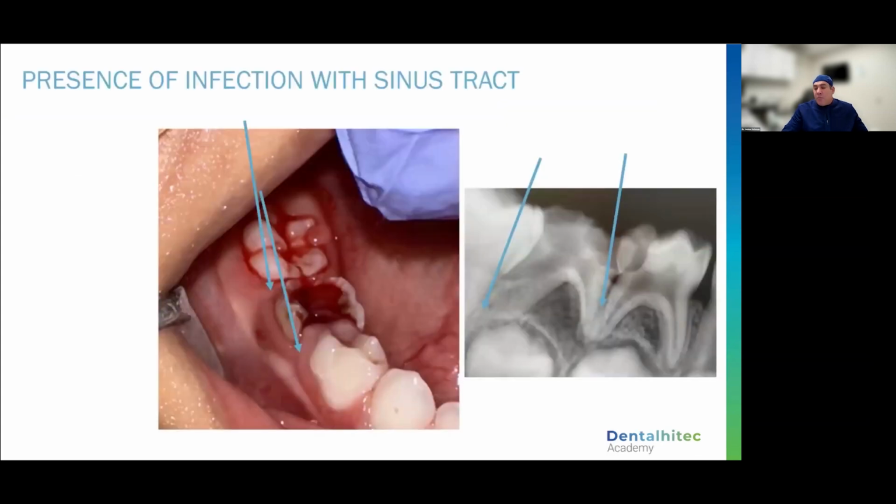Okay. What do we do with the sinus tract or a parulis here? This may be an area where I need to give my IO in 2 sites. And I will often do, if you have a pulp polyp or you have areas of infection or unorganized bone, I may give half that carpule on the mesial and half that carpule on the distal if I'm giving a full carpule, or half and half.